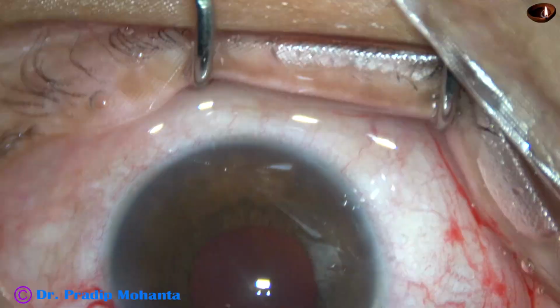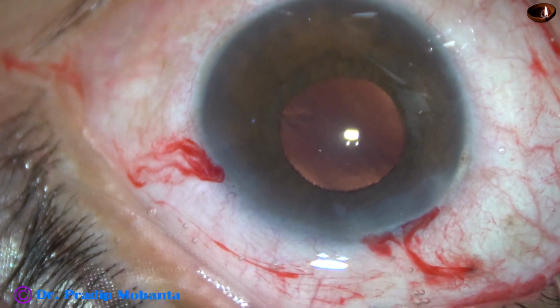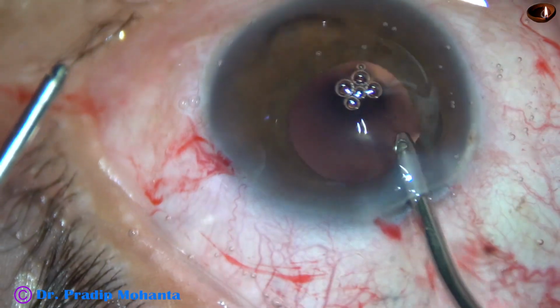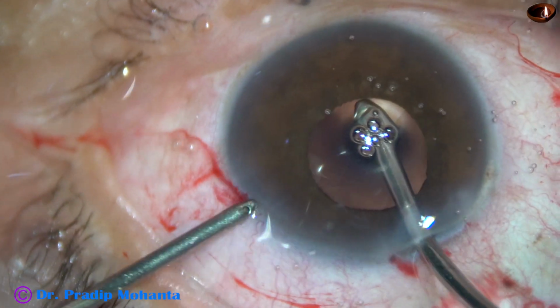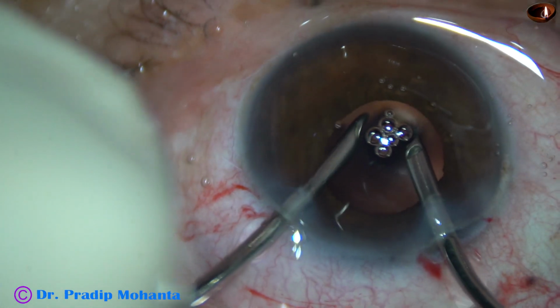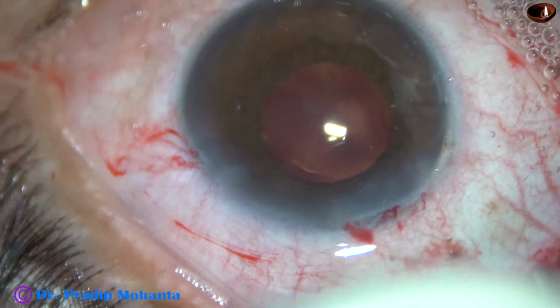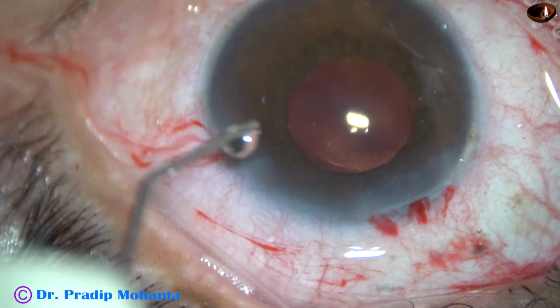And now I'm going to use bimanual irrigation aspiration to remove some more visco. This is the irrigating cannula. It goes in. Irrigation is carried out for a few seconds and then the aspirating cannula goes in, and irrigation and aspiration are done together for a few seconds. So visco cleaning is complete.